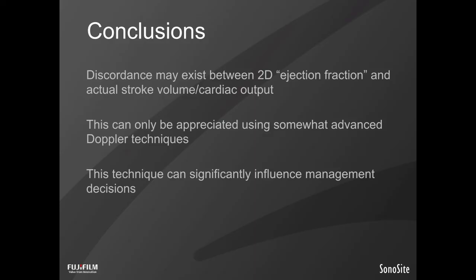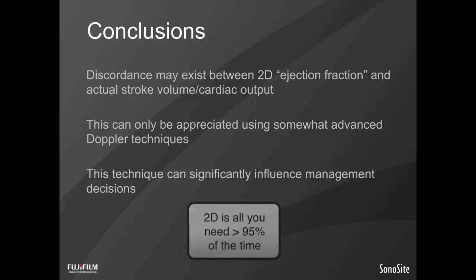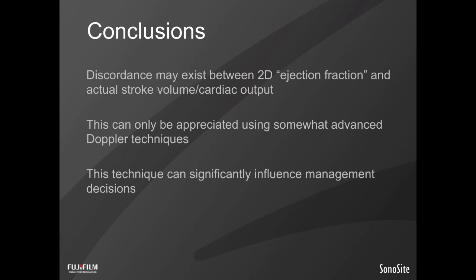Now, I must conclude, however, with my overarching conclusion, which is that 2D methods still 95% of the time are all you need. And you can watch this webinar and be satisfied that that's cool. Some guys who are really passionate about it do this technique, but the majority of the time you're doing a superb job. If you're a well-trained 2D point of care echo person, then you are doing superb work, and you needn't reconsider that based on this webinar. However, if you're itching to get in on these techniques, then perhaps I've given you a bit of an idea about how you may use this stuff.